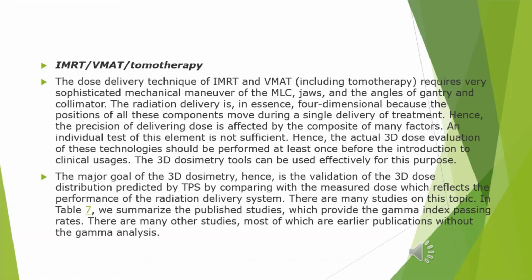Hence, the actual three-dimensional dose evaluation of these technologies should be performed at least once before the introduction to clinical usage. The three-dimensional dosimetry tools can be used effectively for this purpose.